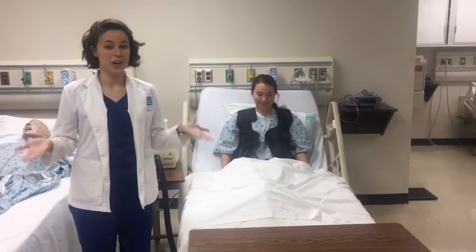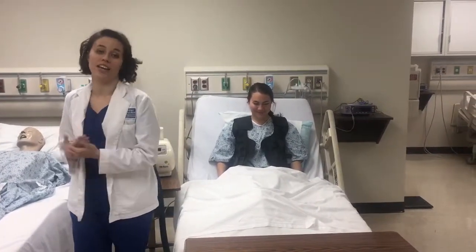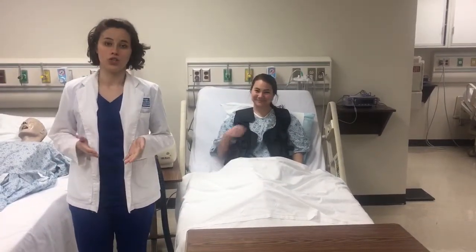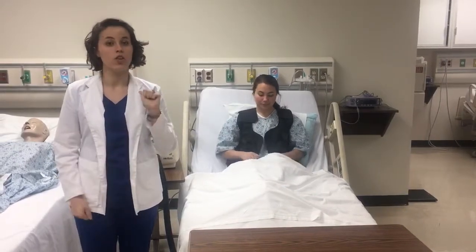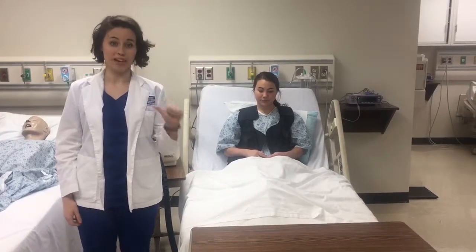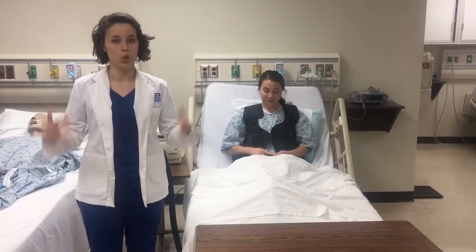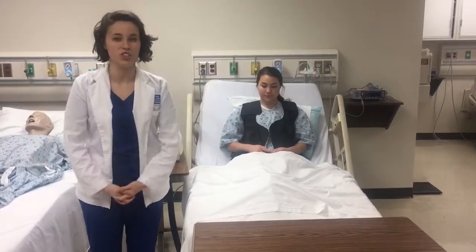So when you're finally ready to apply the therapy to your patient, make sure to recheck the physician's orders or know your facility's protocol for using this device. These instructions will include the settings that you'll apply to your patient, such as the hertz, which is the frequency of the vibrations applied to your patient, ranging from 5 to 25, and the pressure, which is how much the vest is going to inflate around your patient and determine the tightness of the vest around your patient.